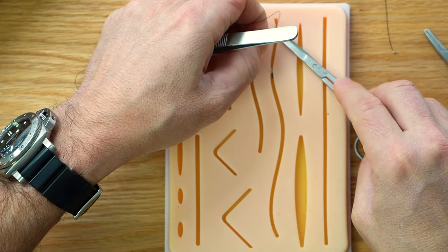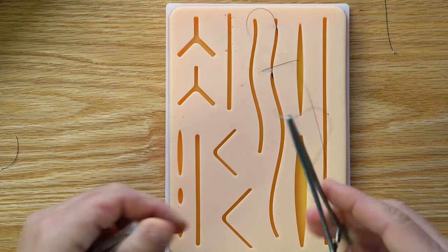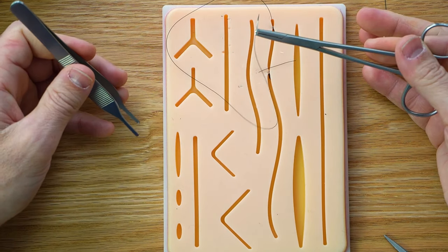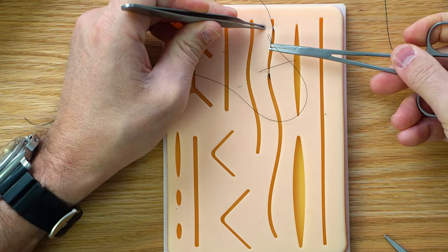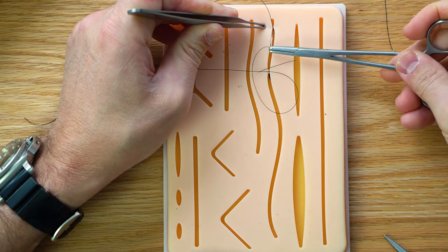So cut that, and then I'll go backhand. I haven't talked about backhand too much, but this is how I do backhand. You see my hand like this? This is essentially how I sew backhand. I don't sew backhand like this, okay? I mostly sew like this.